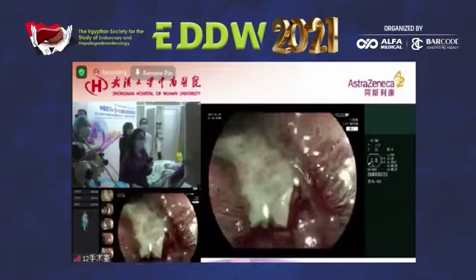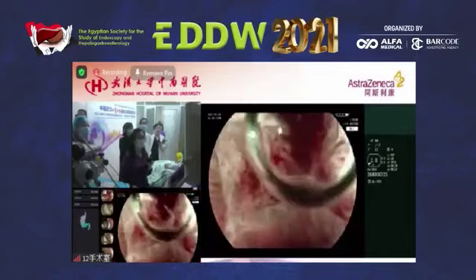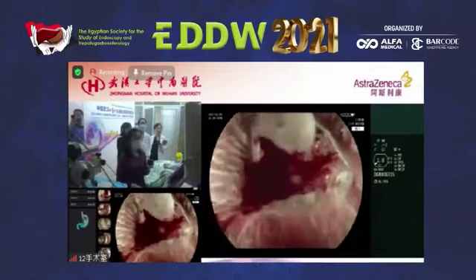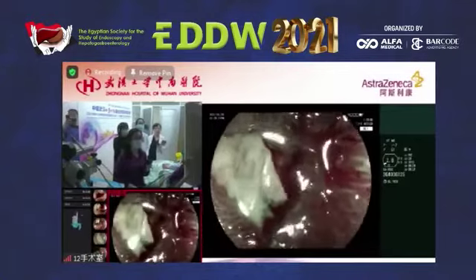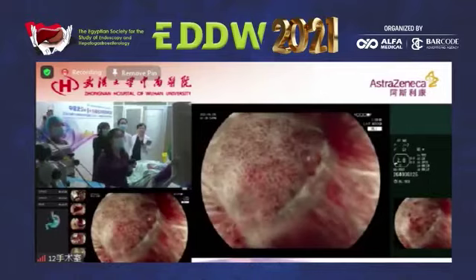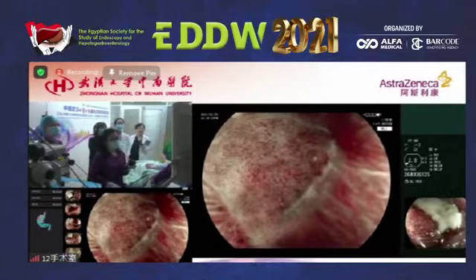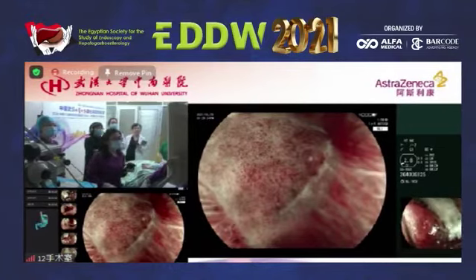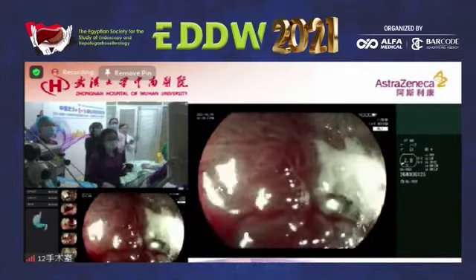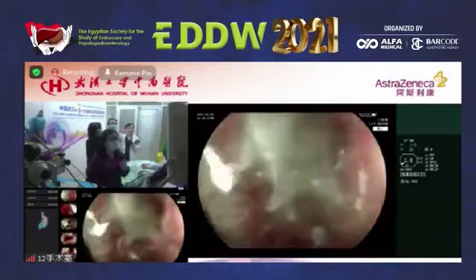I will flush it. Oh, breathing. Flush the foam, flush the mucus. I can see irregular vessels.